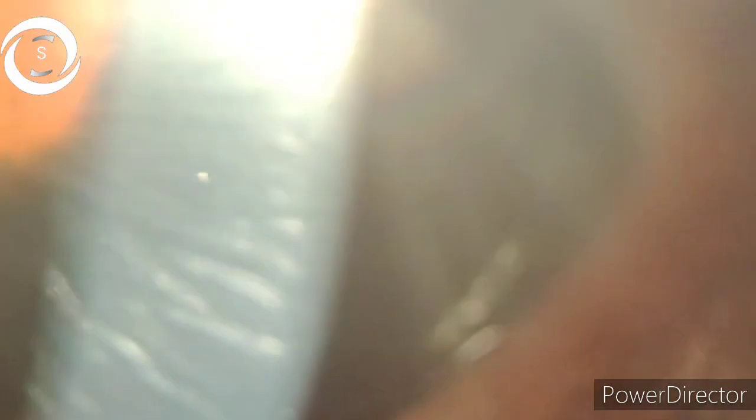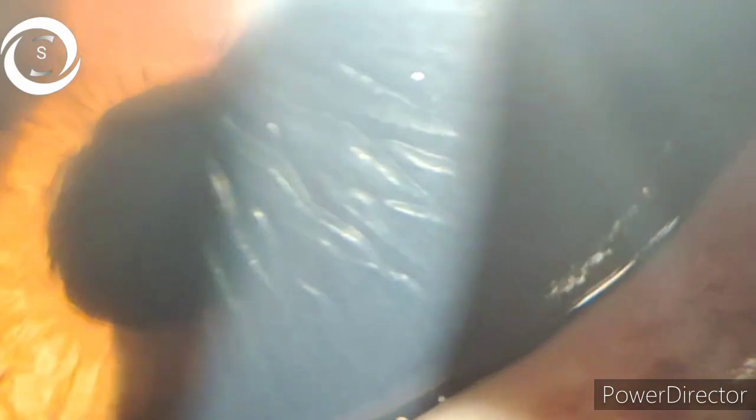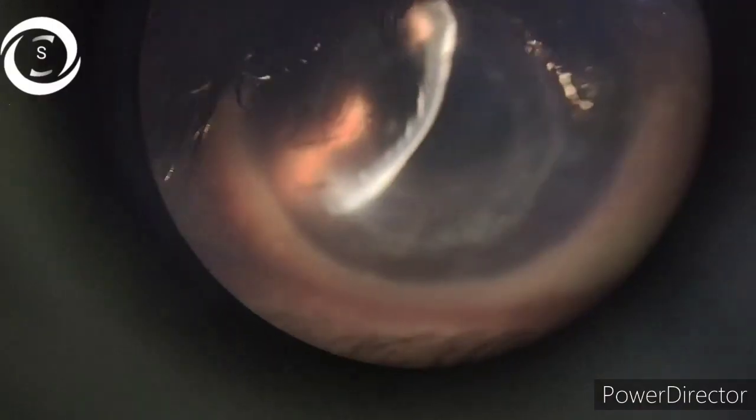Tight sutures cause with-the-rule astigmatism, compress the wound, and you can clearly see these vertical striations in the cornea arranged in a whorl-like pattern.